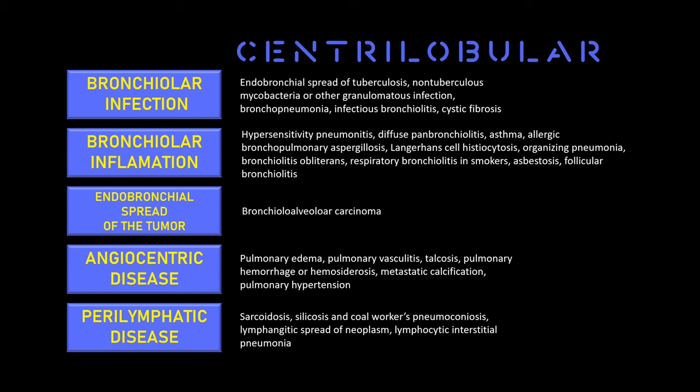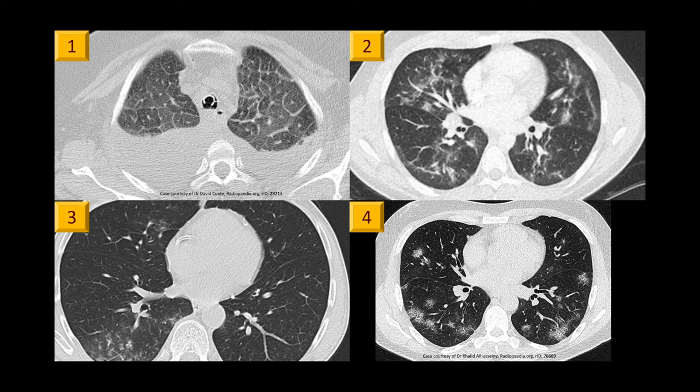Remember that the lymphatics go in the perilobular septa, but they stand in the centrilobular space as well. And now, I'm sure you're confident to say which one of these patients has atypical findings for COVID-19. I'll give you some seconds to think about the answer and how to describe the findings.